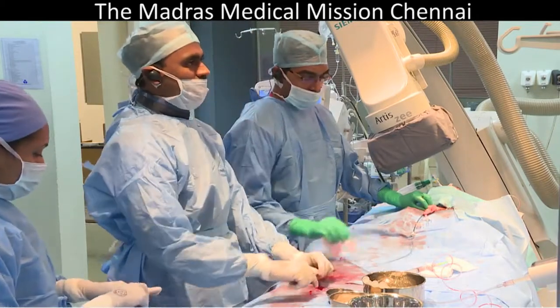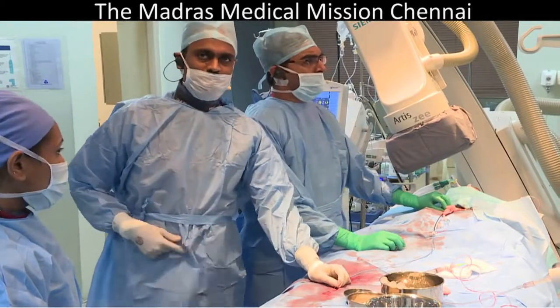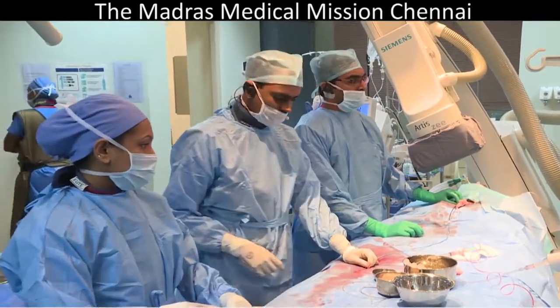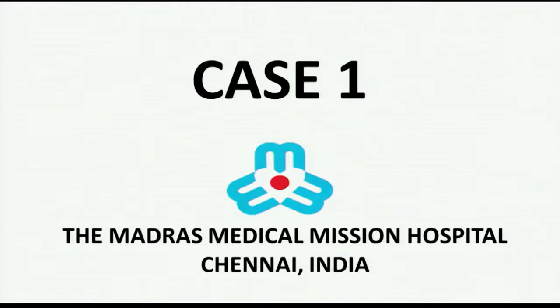In order to match the session for today, we have got 2 right heart interventions for this session. My colleague, Dr. Ronak, will give the clinical case scenario. Good morning, everyone. I'm Dr. Ronak. I'll take you through the first case for the transmission.